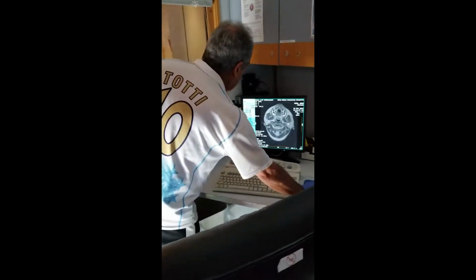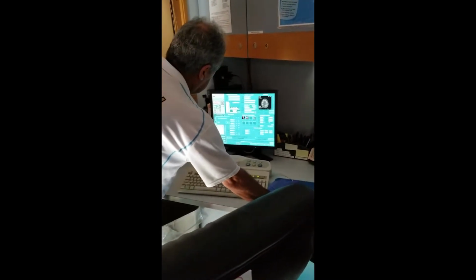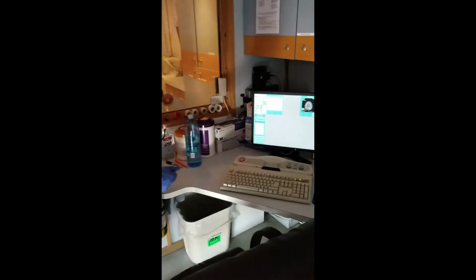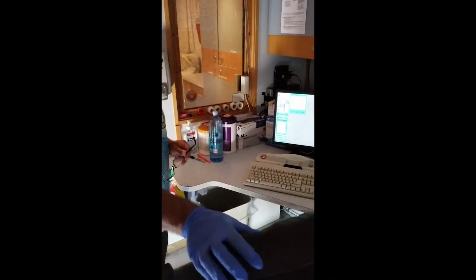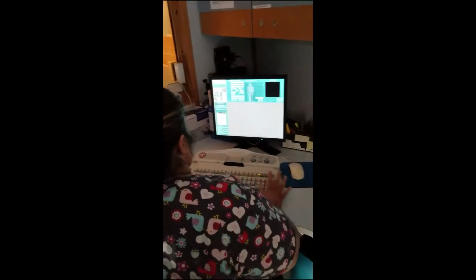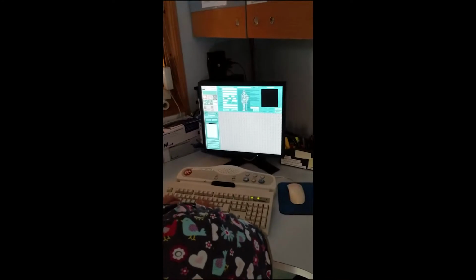Okay, so when we're done, we go to idle. We end the exam. You must end the exam. Confirm. You're done. Next. Okay, so now we just put the information, just a bogus number, right?